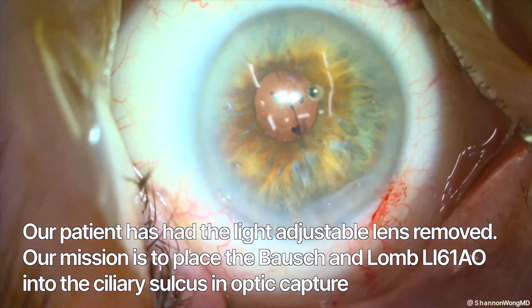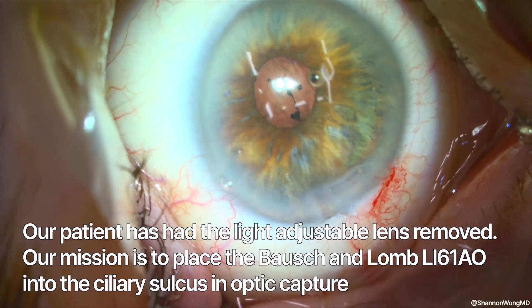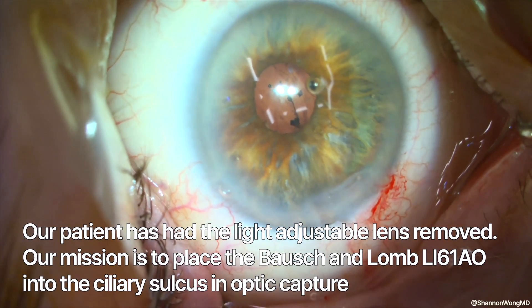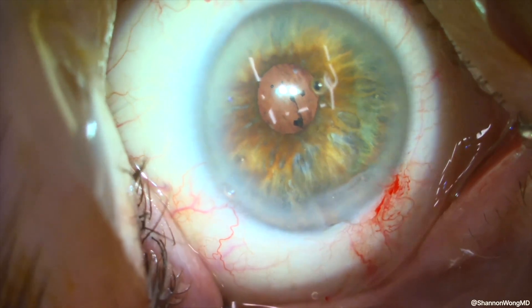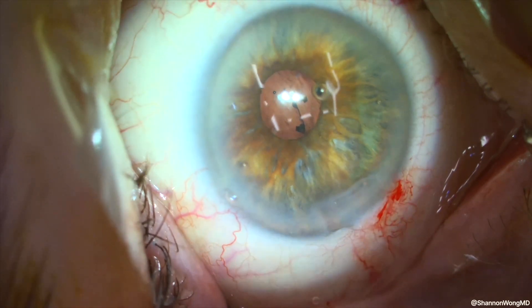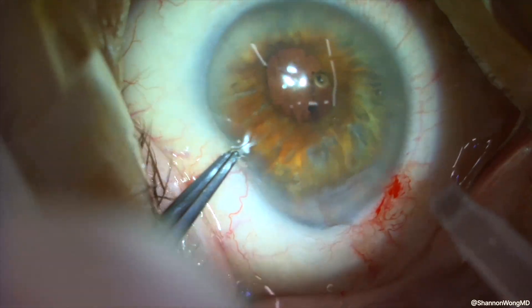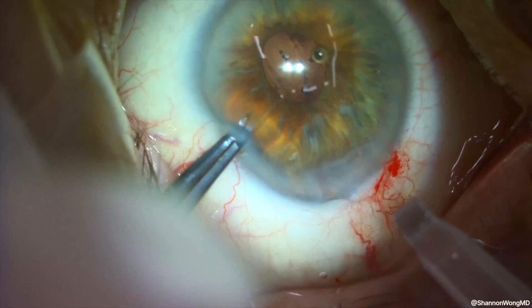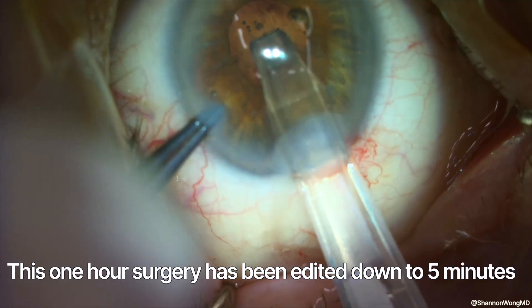This case represents that 1% of intraocular lens exchanges that can become very complex, very fast. The video posted yesterday covered explantation of a light adjustable lens post-YAG capsulotomy. In episode 2 today, our plan is to place an LI-61AO monofocal lens into the sulcus and perform optic capture, where we place the optic posterior to the anterior lens capsule. What I'm going to show you is 1 hour of surgery in the following 5 minutes.